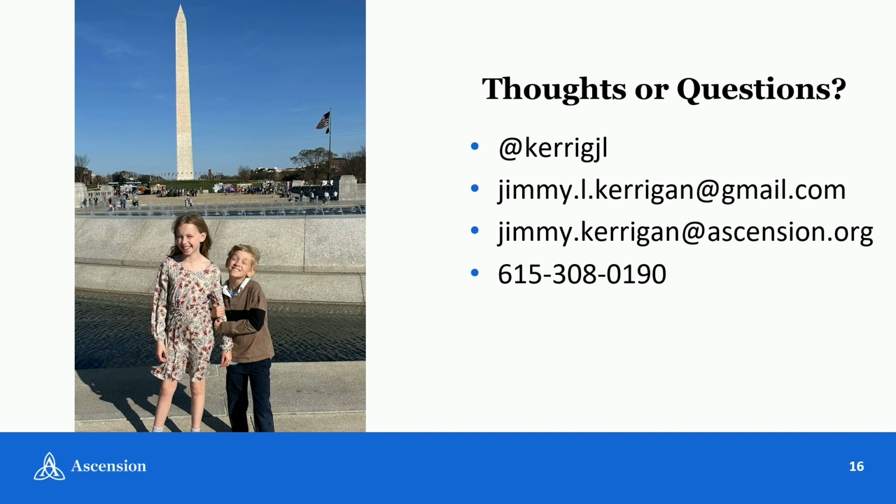Yeah, I think one of the things we should make people aware of as well is that when the company is validating, they're looking at all different qualities of scans and all different vendors, because they understand that limitation. So they're really trying to take each plaque analysis to the next level, looking at just those issues. Just as FFR technology has gotten better, plaque technology is always going to get better and more reproducible with time too. But I think Ron's point is probably the best made: concentrating on consistent, good quality images, regardless of 64-slice or photon counting CT.